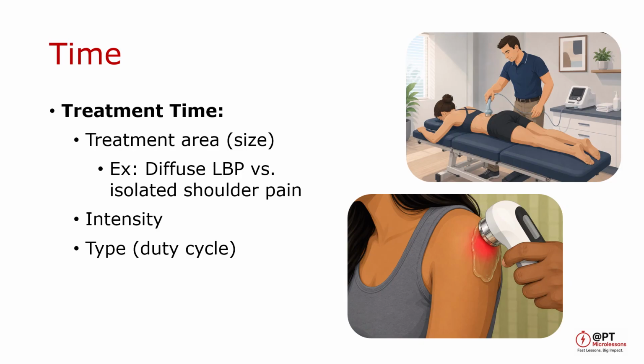Next, if you need to lower the intensity for patient comfort, less energy is delivered to the tissues, so more time is required to achieve the desired effect. Now looking at duty cycle, if the ultrasound is pulsed, it is on only part of the time, so less total energy is delivered than with continuous ultrasound, which again means the time must increase. When we step back, there is a consistent pattern. When energy delivery is reduced, time needs to increase. And this is the key idea. Time is how we make up for less energy delivery.